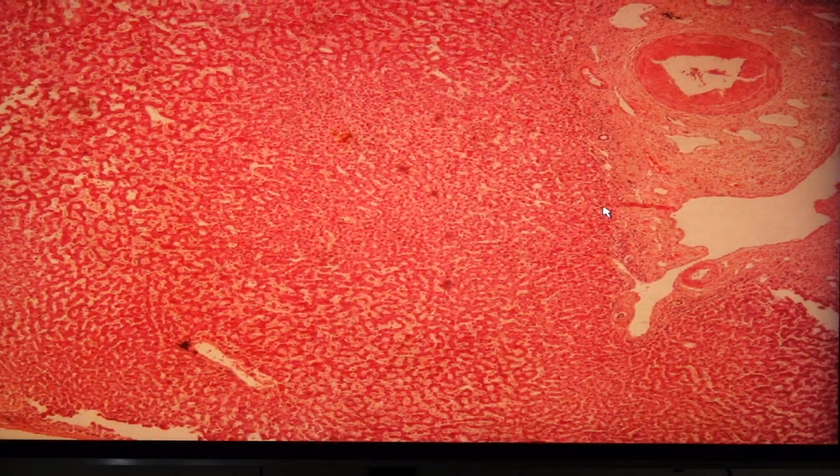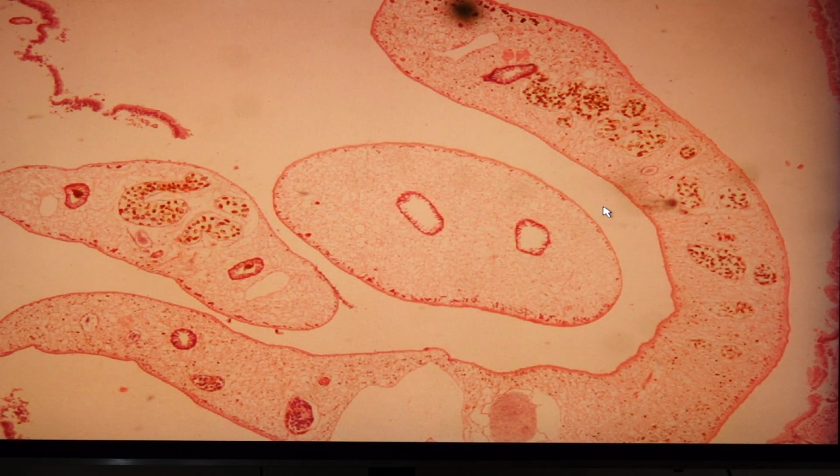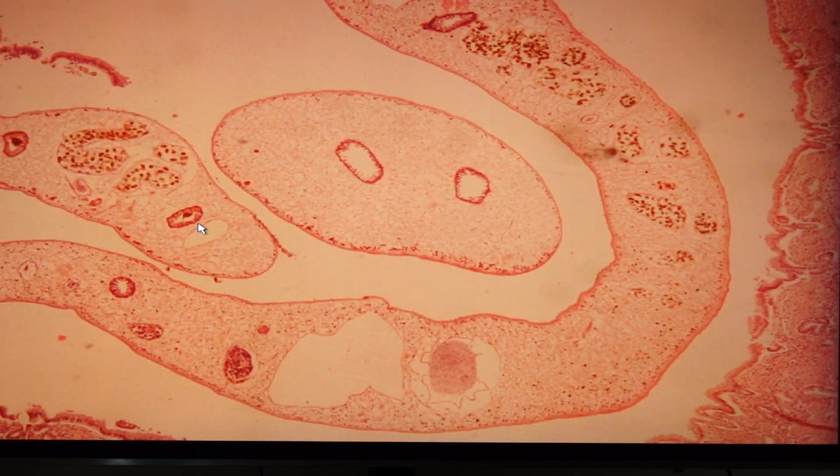In this case, what you have to look for is this one, because slide 127 is the liver fluke. And what are examples of liver fluke? We have Fasciola hepatica, Clonorchis sinensis, and Opisthorchis viverrini. This would be the liver fluke. I think this would be explained better by Dr. Salaver and company. We can see the presence of the ova in this case. So this is a large duct that would contain the liver flukes.